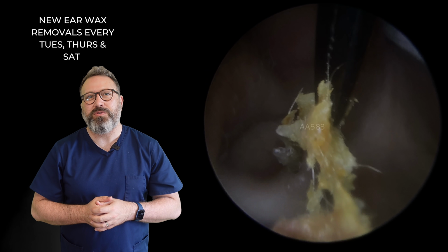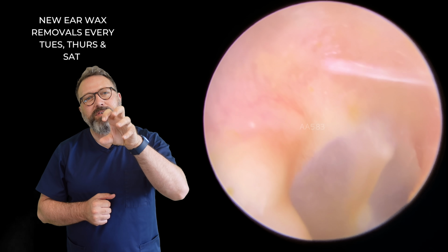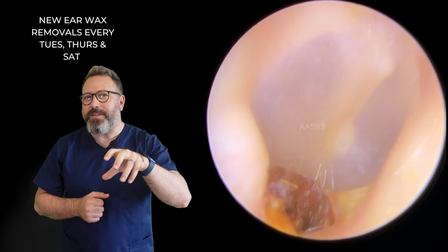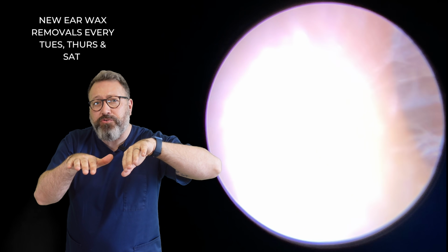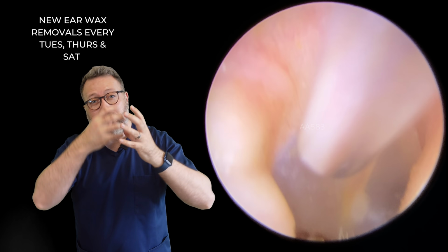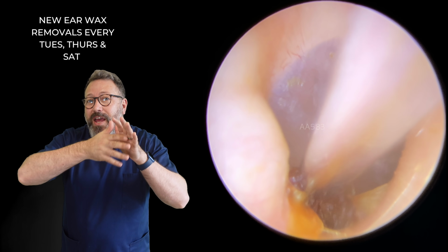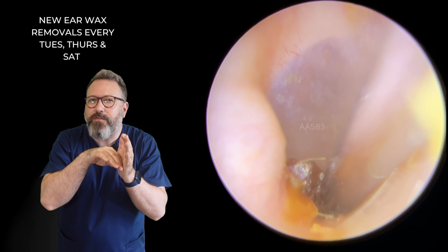So that's that whole section you can see with that long strip of dry skin. But take a look behind this now. Look down at the eardrum, at the bottom of the eardrum. You can see that little section there. Now what this is actually is a piece of dry skin that's migrated off the eardrum, because skin is constantly trying to migrate off the eardrum all the time, and that's what forms our ear canal wall skin. And then it's settled down in that little recess you can see there. So that little valley we talk about just in front of the eardrum.